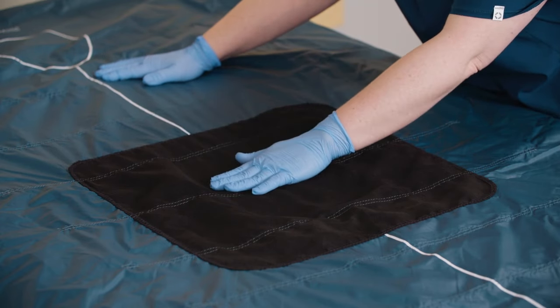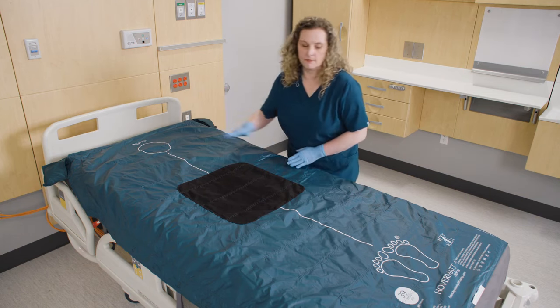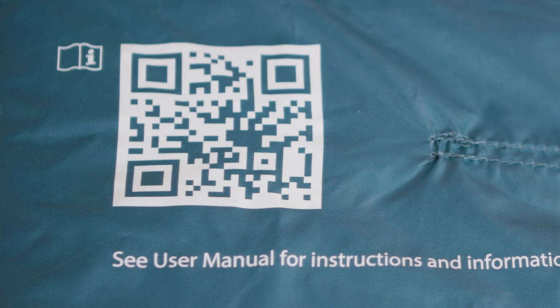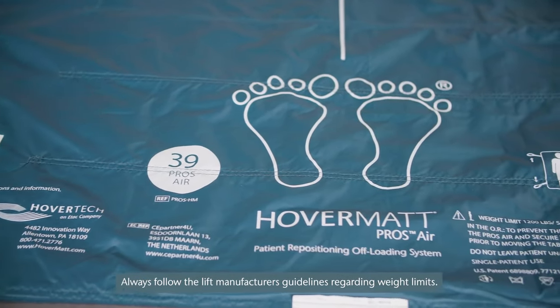The holding patch keeps the hover cover in place to reduce movement and bunching. The head and foot end indicators show proper patient placement. The QR code provides easy access to instructions for use and product videos. The weight limit for the HoverMap Pro's AIR is 1,200 pounds.